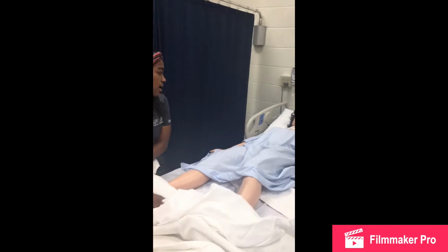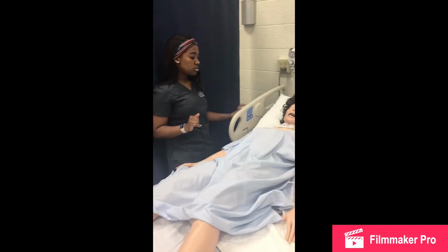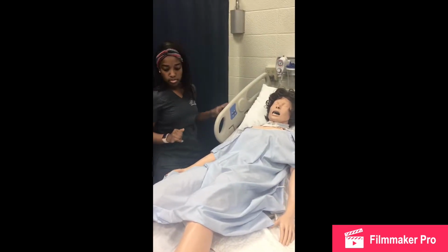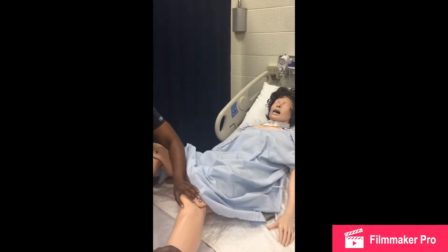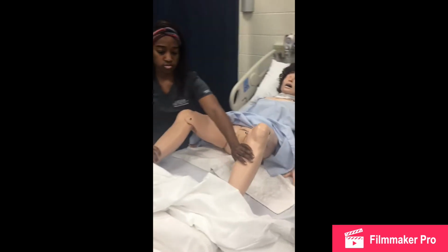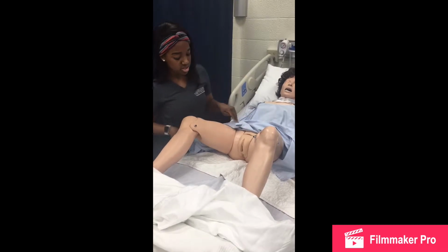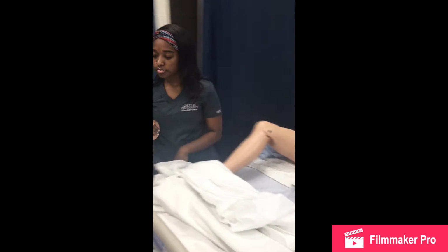I'm going to roll this back. I'm going to move my patient up a little bit. And then I'm going to adjust my patient. While I'm adjusting, I'm going to make sure that my patient doesn't have any residue on their private area. She does not, so she's okay.